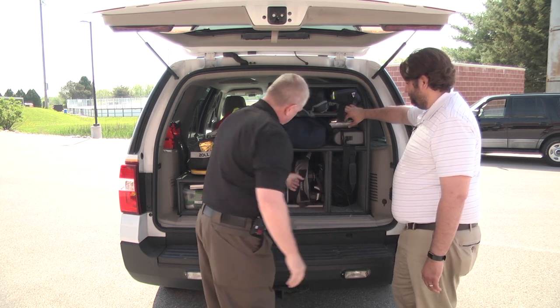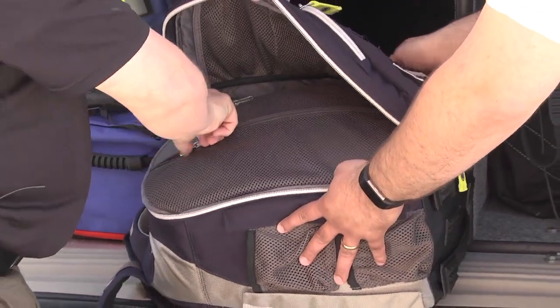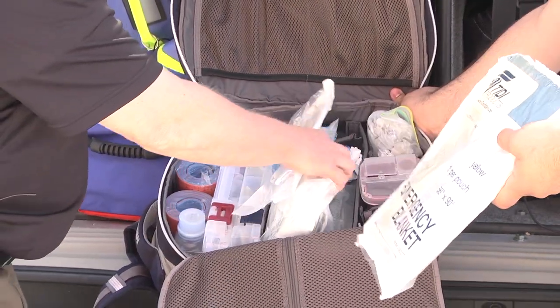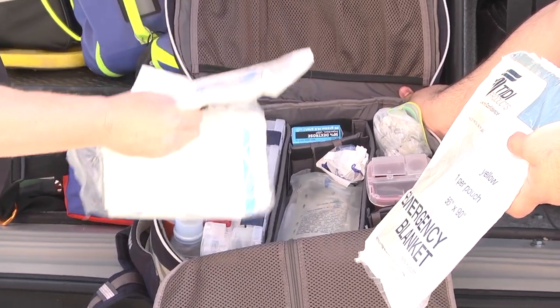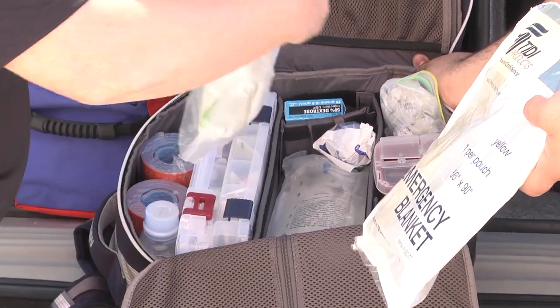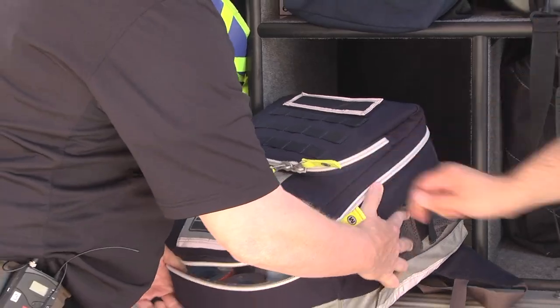Down below, we have our airway stuff. We have, I think this is the drug bag. Let me help you out with that. Yeah, thanks, right there. So as an advanced level care, we can start IVs, we can give dextrose, we can give some Benadryl for allergic reactions. We have the Epi. We can do some basic splinting, some basic airway stuff. Emergency blanket, and if somebody decides to have a baby, we can also help them with that. Well, Car 15 can do a little bit of everything.